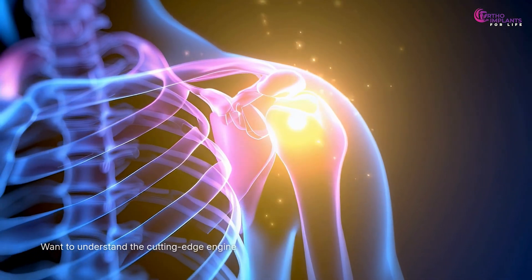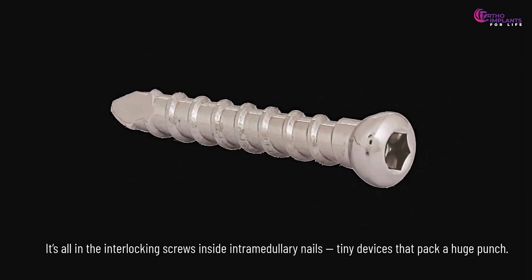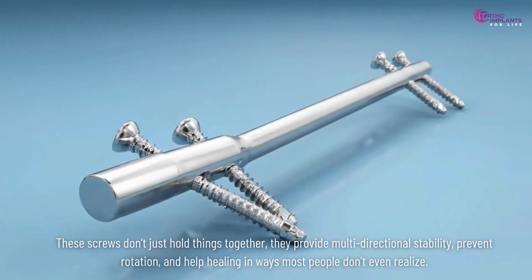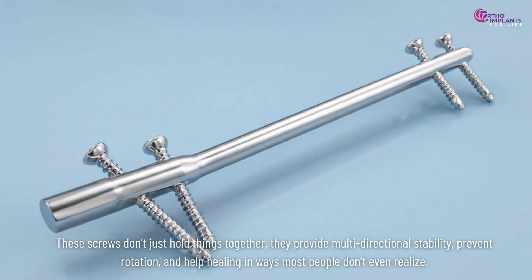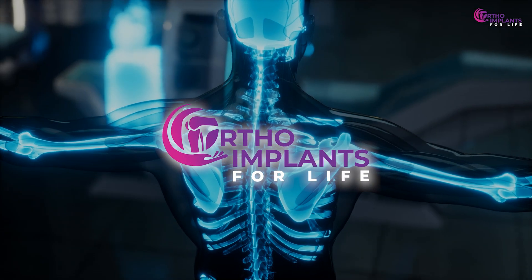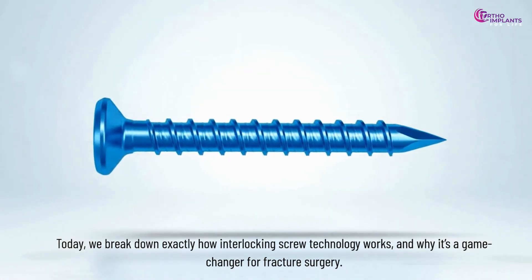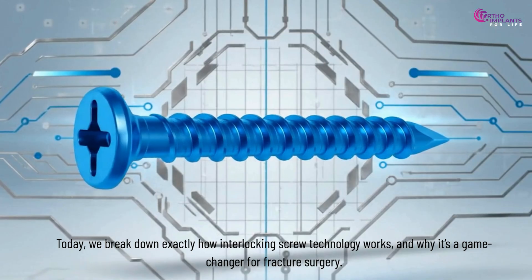Want to understand the cutting-edge engineering that makes modern bone repair incredibly effective? It's all in the interlocking screws inside intramedullary nails — tiny devices that pack a huge punch. These screws don't just hold things together; they provide multi-directional stability, prevent rotation, and help healing in ways most people don't even realize. Welcome to Ortho Implants for Life, your one-stop destination for all orthopedic-related implants. Today we break down exactly how interlocking screw technology works and why it's a game-changer for fracture surgery.